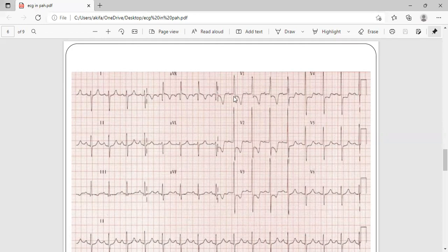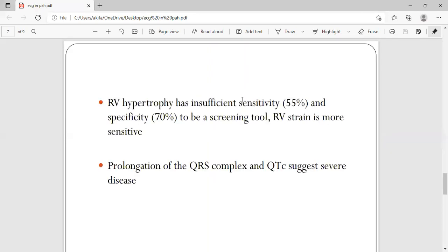Along with the hypertrophy changes, if you see ST depression with T wave inversion, this is called RV strain. RV strain is more specific and sensitive for right ventricular hypertrophy.